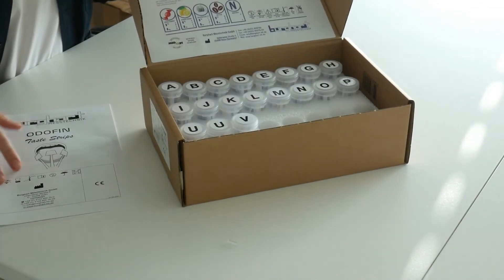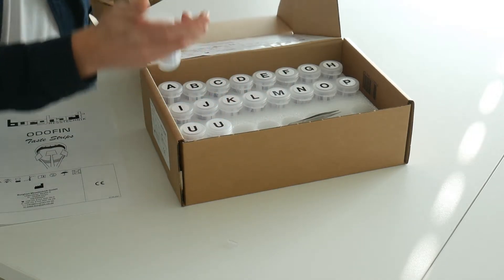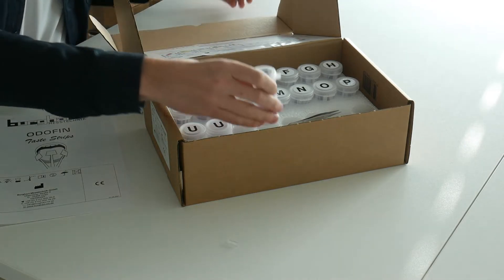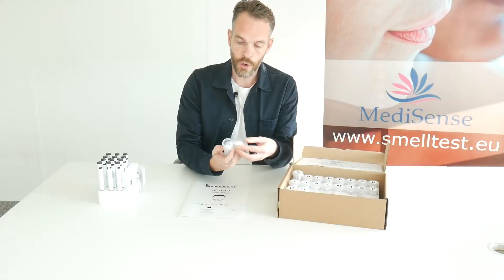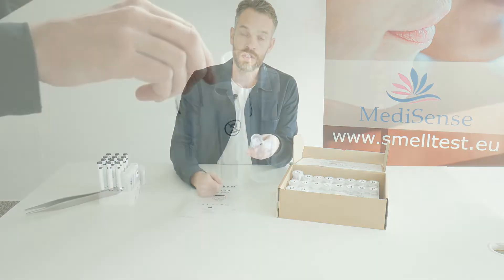As you can see, the taste strips will be delivered in tubes. There are 50 taste strips in each tube, which means you can use this kit to test 50 people. To open the tube, you can take the tweezer and take out the taste strip.